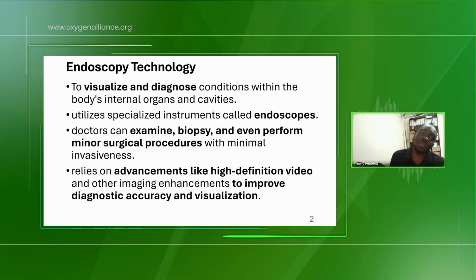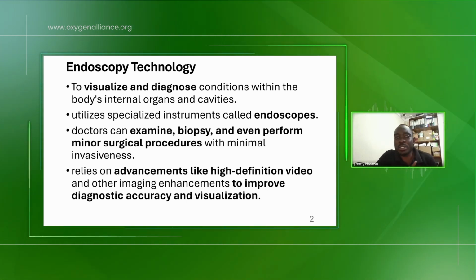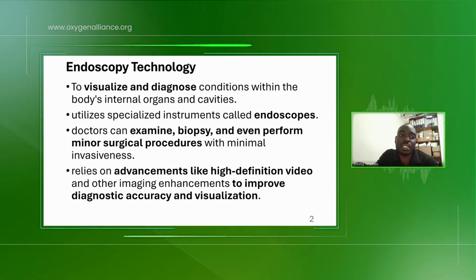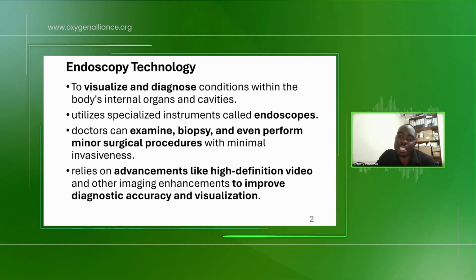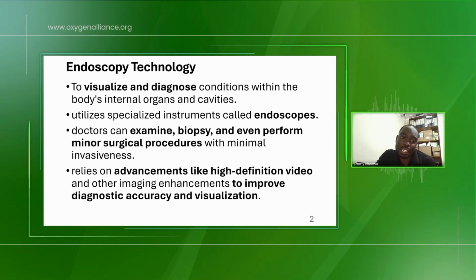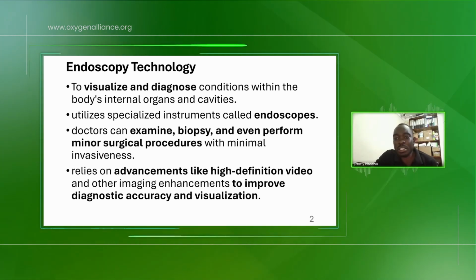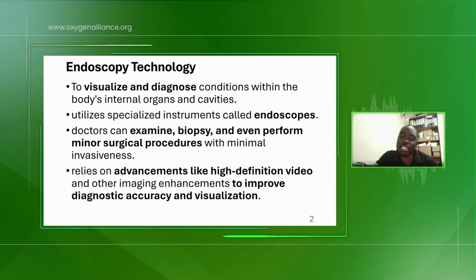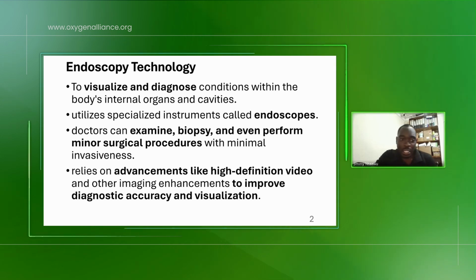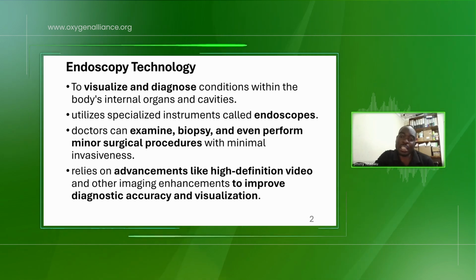So when we talk of endoscopy technology, we are talking about the kind of technology that we use to visualize and diagnose conditions which are within the body, internal organs, and cavities. This kind of technology uses what we call endoscopes. These are the actual machines, and the doctors use them to examine. They can use them to pick biopsy samples. They can also use them to do minor surgery procedures. These are usually procedures which don't require much invasiveness into the body.